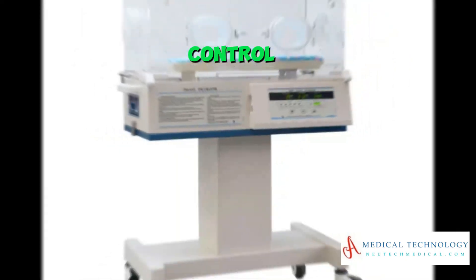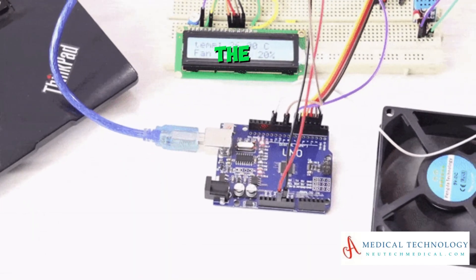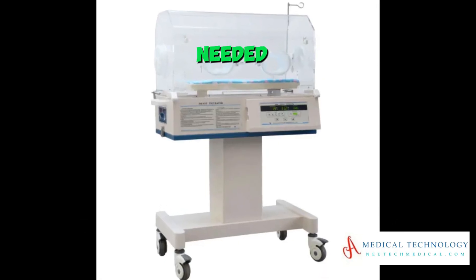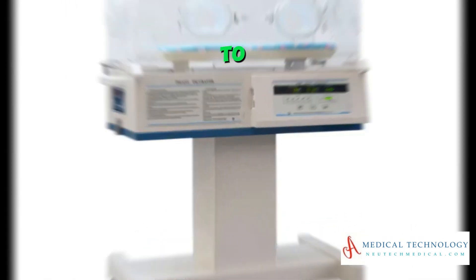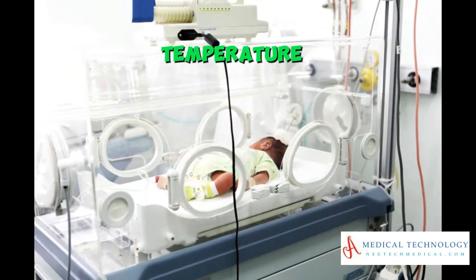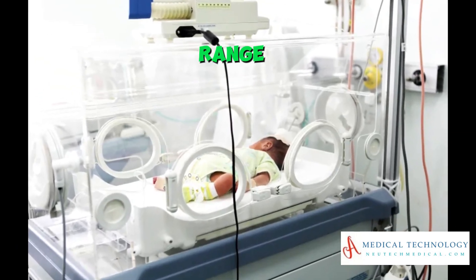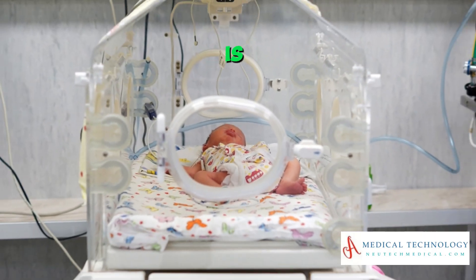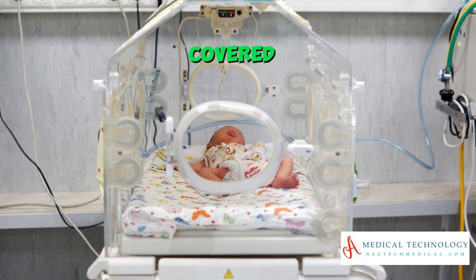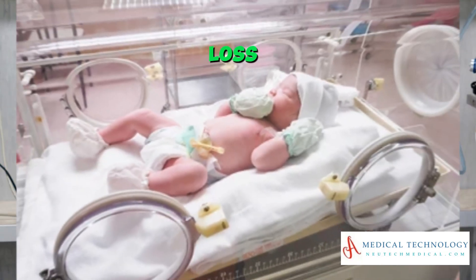Temperature control: Monitor and adjust the incubator temperature as needed to maintain the infant's body temperature within the normal range. Ensure that the baby is appropriately dressed or covered to prevent heat loss.